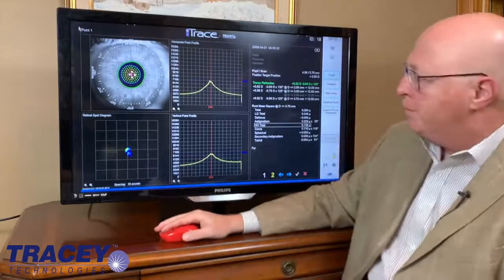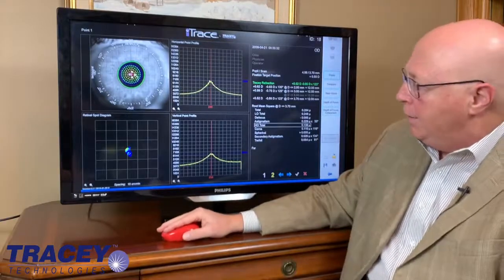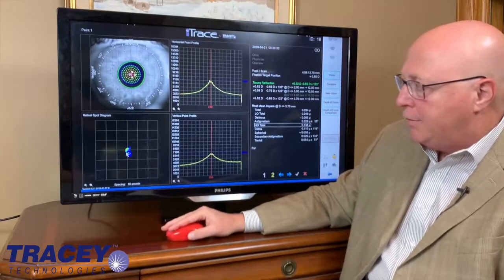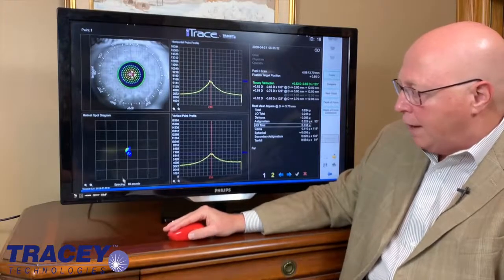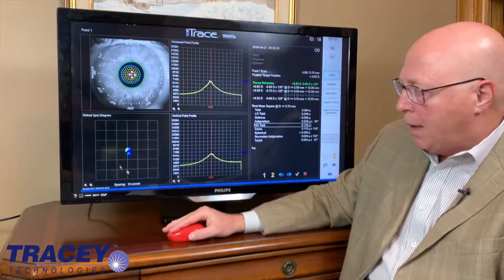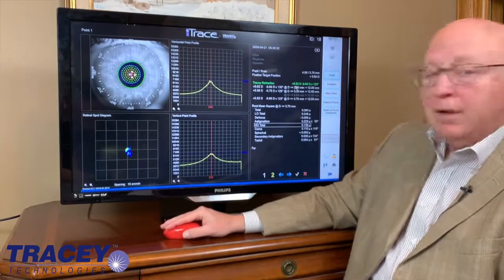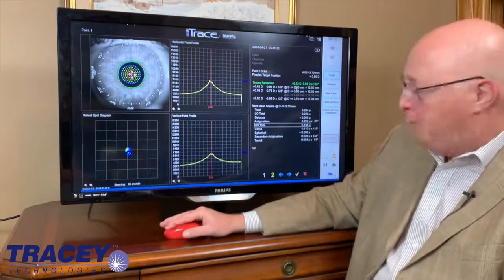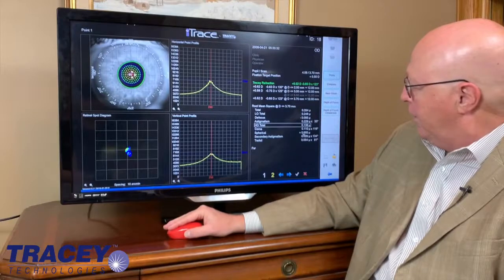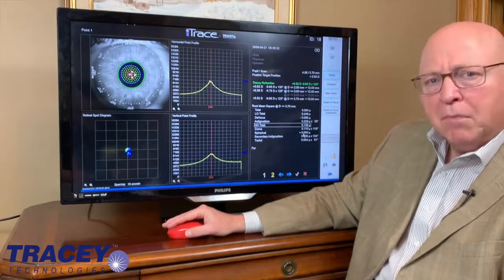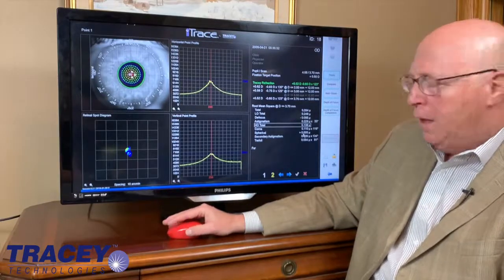Let's take a look. So this is the lasers going into the eye, a tight cluster on the retina — this is a one-by-one of the macula — and that shows us that the patient is near plano. It also shows us that his spherical aberration is a little bit plus but close to nothing.